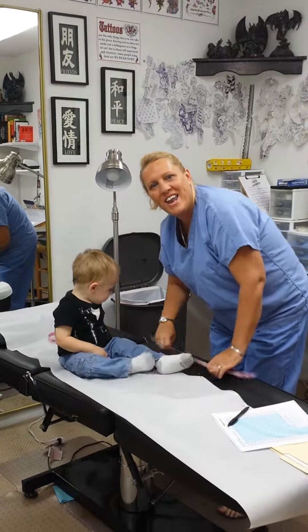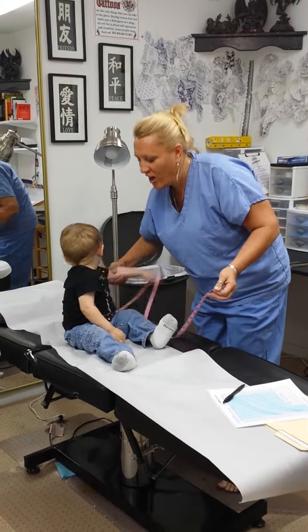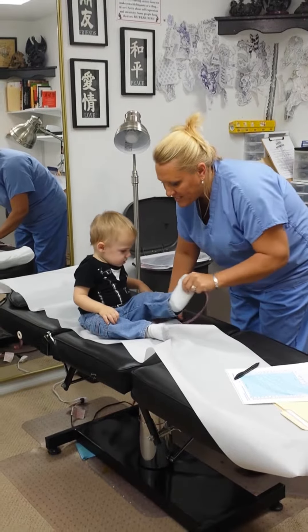Hi, my name is Mindy Shiver, and I'm going to show you a couple of measurements that are done in the pediatric office on a toddler. Today we have Richie, who is 18 months old, and he's going to be helping us out.